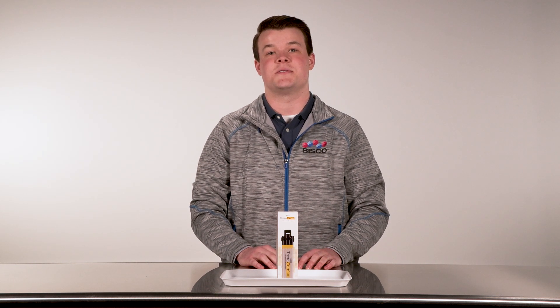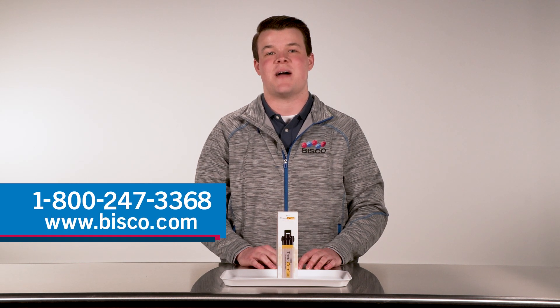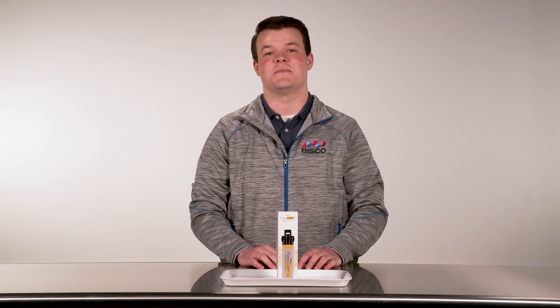Remember, don't forget to go over the instructions for use. Should you have any questions, give us a call at 1-800-247-3368. Do you think bonding with the zirconia is complicated? Not anymore, with Therasem's single-step procedure.